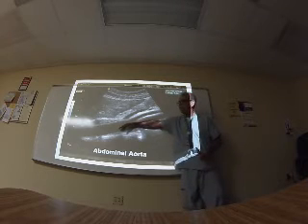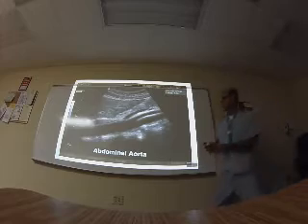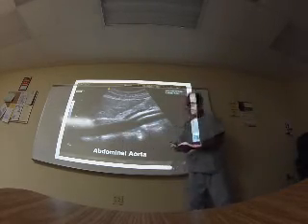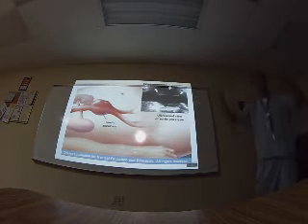And posterior to the aorta, what is this? The vertebral column. You can see here nothing important because this is a bone. You can see here an aneurysm. This is a typical pathology.